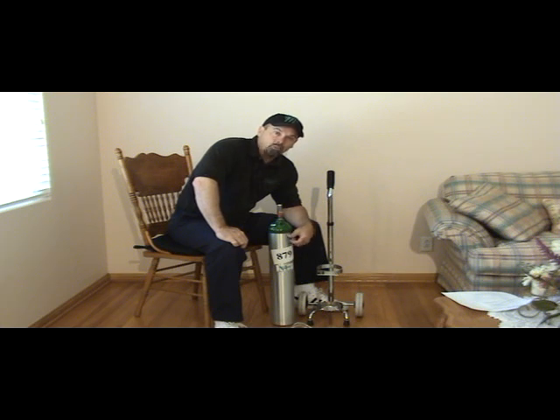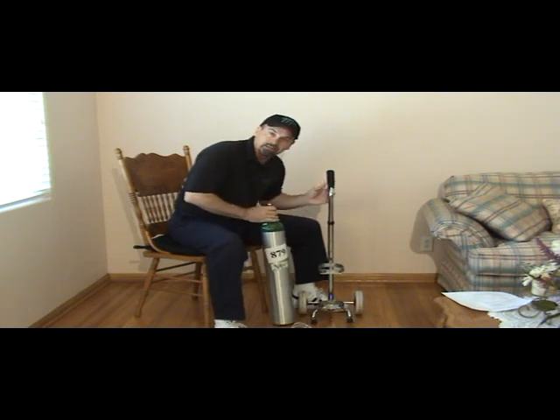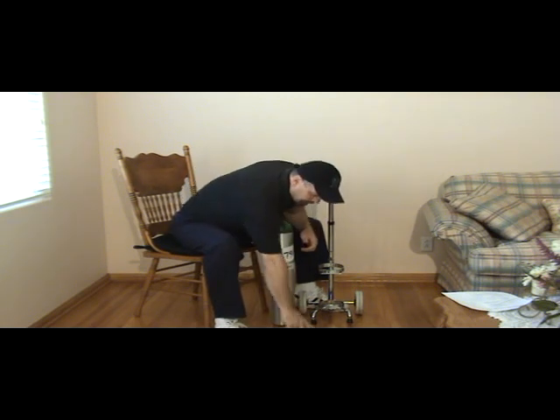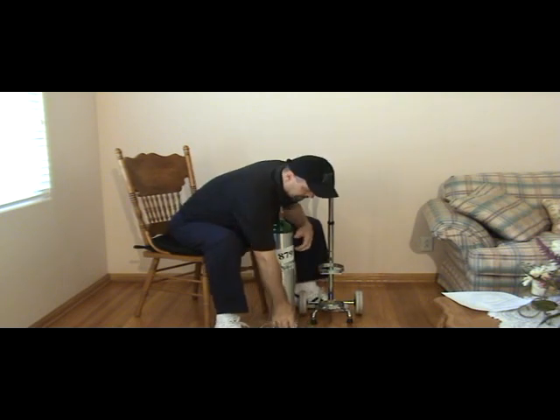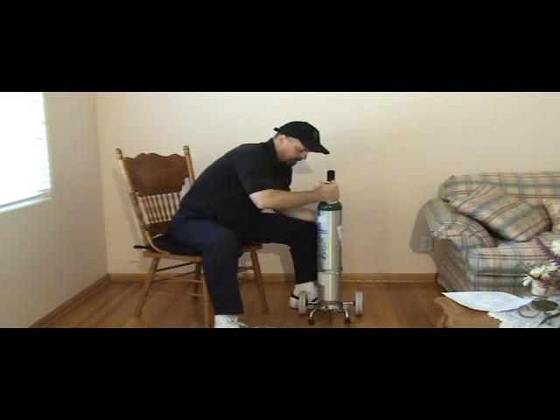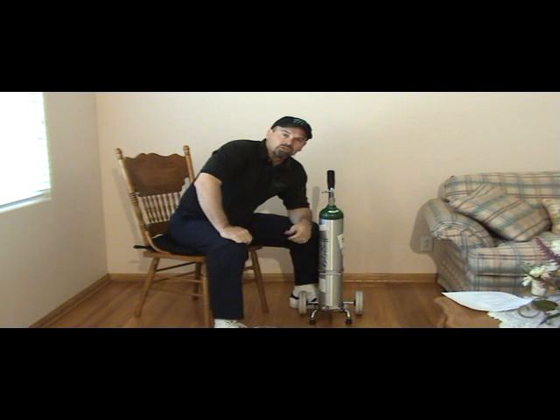So as a backup, what we provide is what you see here. A backup unit consists of a cart, a tank, usually an E-tank, although there are other sizes, a regulator that regulates the flow from the tank to the patient, and a nasal cannula or mask. The tank goes inside the cart like so, and next I will show you how to hook up the regulator and the nasal cannula.